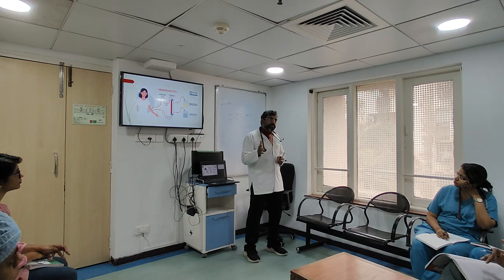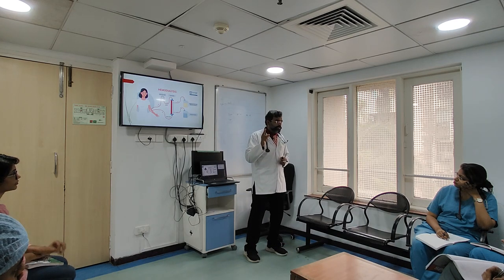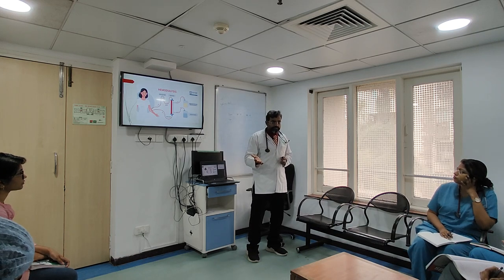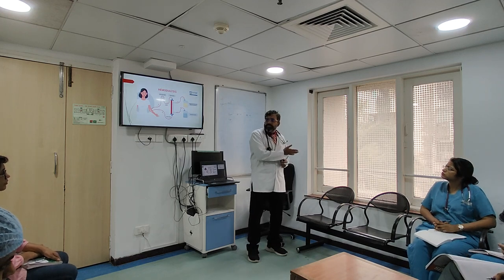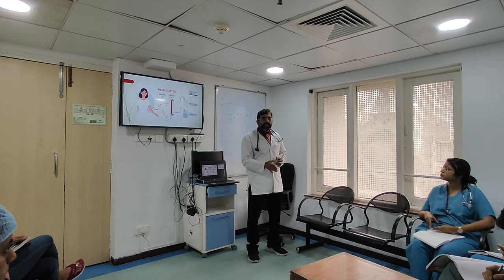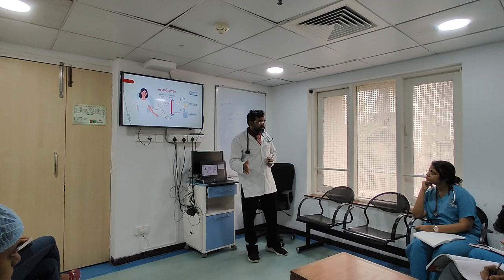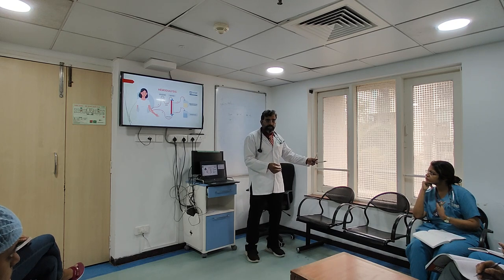Nothing will deteriorate immediately unless it is fluid that deteriorates a person immediately. An aspiration or a developing pneumonia will take time. So it is but logical that if the patient was at 98%, it has become 92%, and the patient has become breathless. The B-lines over there are nothing but confluent B-lines of fluid overload that you're seeing on your ultrasound. So the next step, what you think in your mind is, oh, I have my dialysis going on, let me just increase my UF.